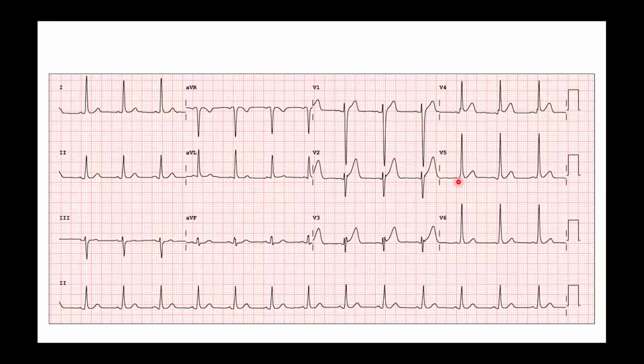With this ECG, we can see the subtle signs of pre-excitation. Usually, in the ECG, we have the Q wave in lead 1 and aVL. Lead 1 is especially sensitive when compared to V6 also. In normal individuals in the sinus rhythm ECG, you can see the Q wave in 1 and aVL. Here, the Q wave in lead 1 is absent.